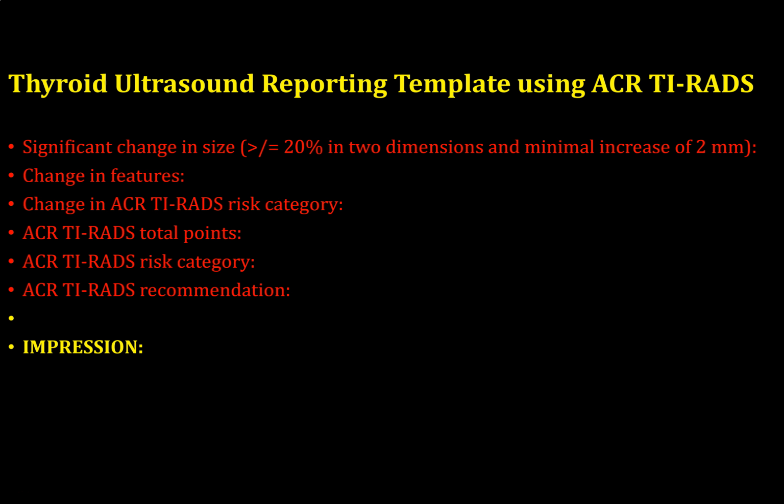I personally record the dimensions from the previous exam. Some may consider this to be extra work, but I prefer it. I like to ensure that the measurement technique is stable in both exams. I will also give the size dimensions from the earliest or more remote exams to really document the stability over time. That's something I go to the effort to really state, that this nodule has been stable for 5 years or 10 years. I do recommend creating a reporting template that combines the TIRADS recommendations into one neat little package.